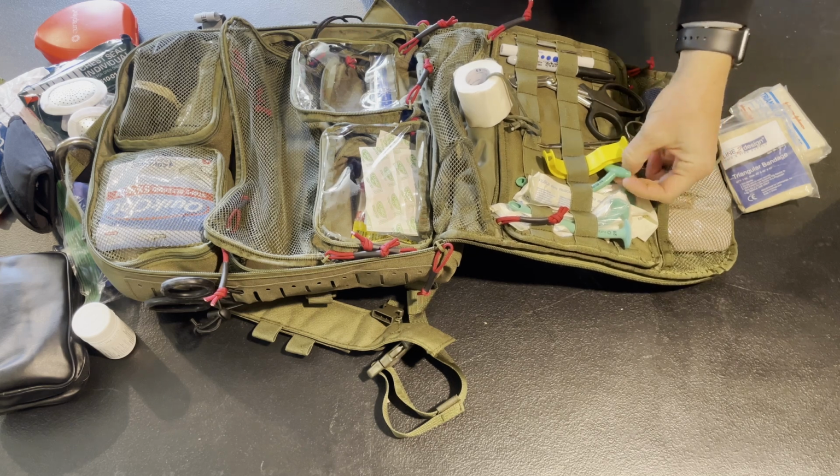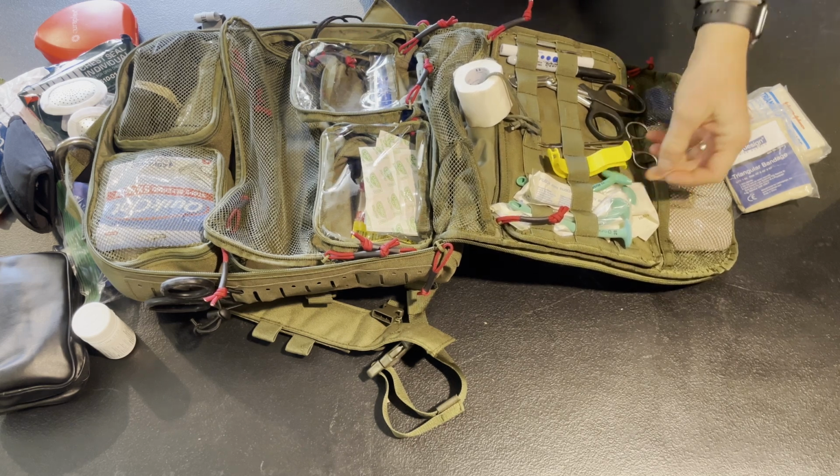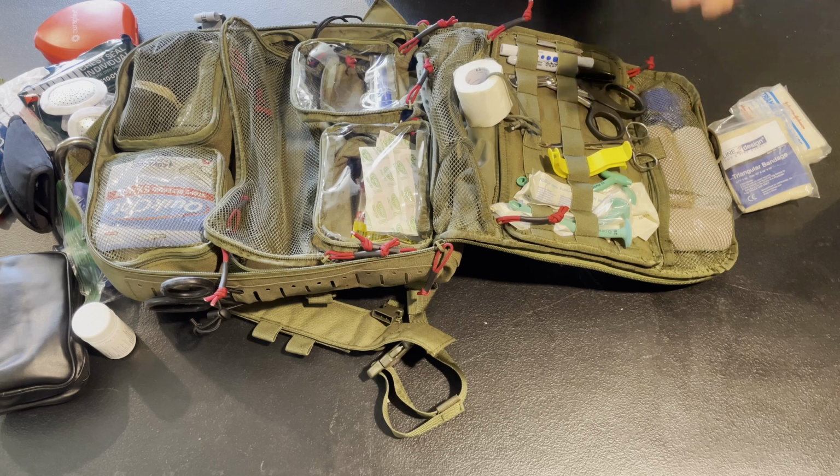I know it's not sterile. I don't really care. Because a 24 to 26 to 28 size is going to be, really 24 to 26 is going to be the average size that you would use for your standard adult male. So I keep those ready to go. I don't have any smaller ones, so I'm not too worried about it.